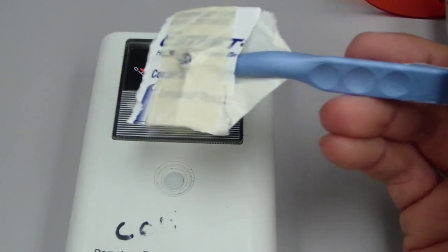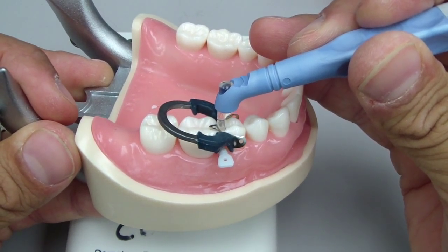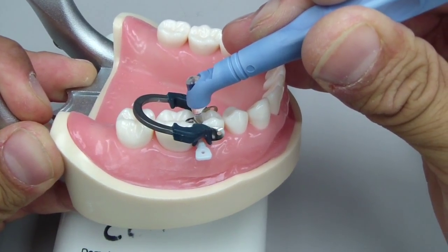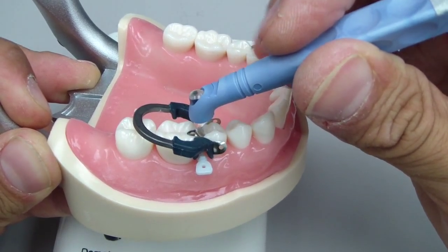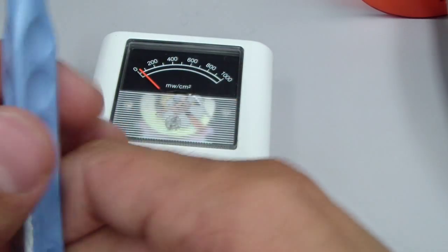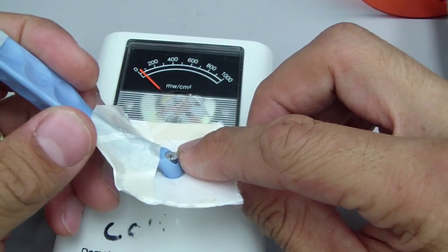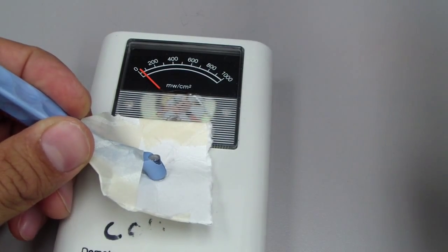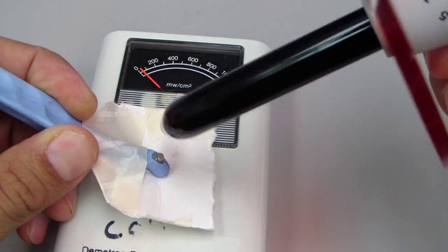Now let's consider when you use this instrument intraorally — you're placing it into the proximal box at the gingival floor and placing pressure against the adjacent tooth. You won't have a lot of light being transmitted except through this little light tip. So let's simulate that — this is some cardboard covering up as best as possible — and see how much light is going to be transmitted.